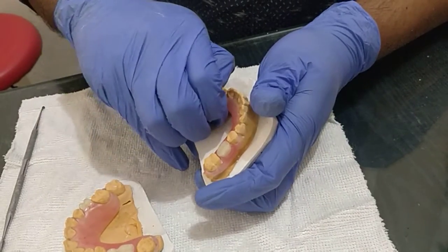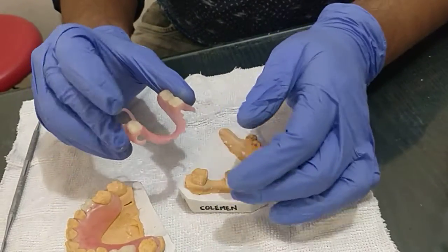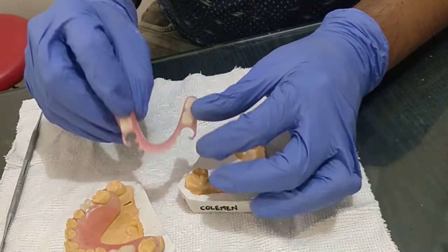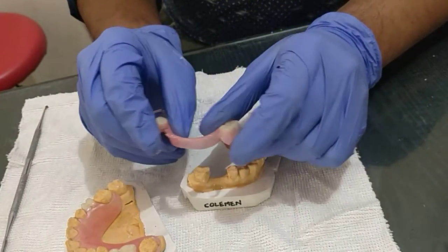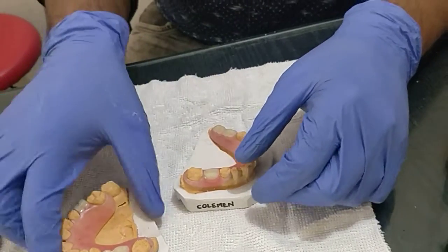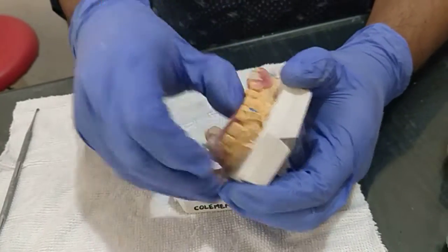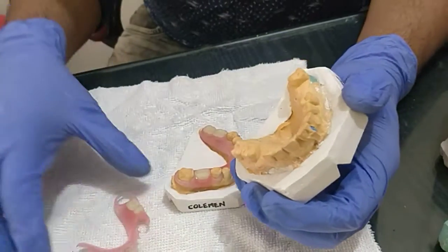I have constructed this flexible partial plate denture. You can check the flexibility — see how flexible it is. It is nicely made. Let me also show you the flexibility of the upper one so you can see.